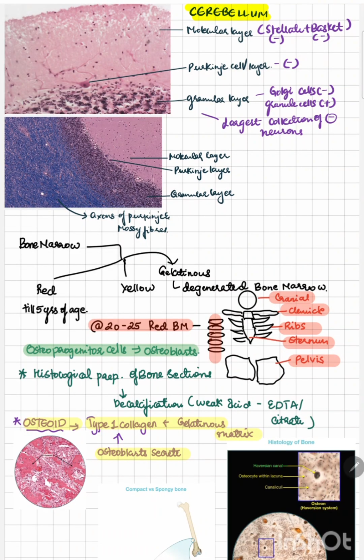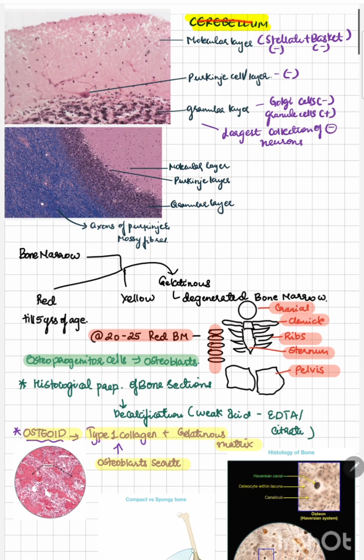Hey everyone, I'm Dr. Divya, and during my NEET preparation, I had collected some really important histology slides that are frequently asked in NEET PG exams, also in the FMGE exams. So, in today's video, I'll just go through some of the really important slides, and now without wasting your time, let's dive into it. The first one is about cerebellum.